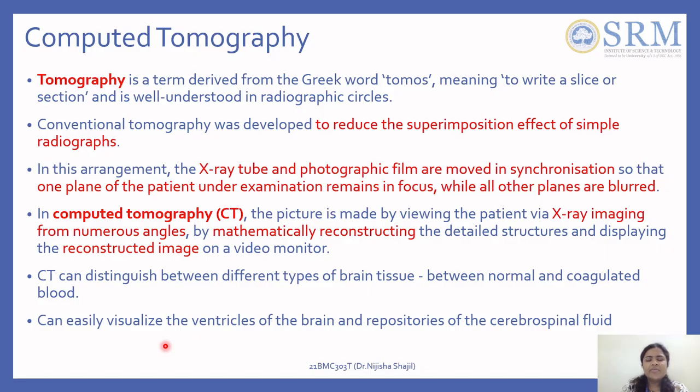So in this case, you view the X-ray imaging from different angles, and to get the image back, you send X-rays and use mathematical reconstructions. It is not simple: you have multiple X-rays, and you combine all of them. You use a reconstruction technique to reverse it, find out how the X-rays are, and then create the image.